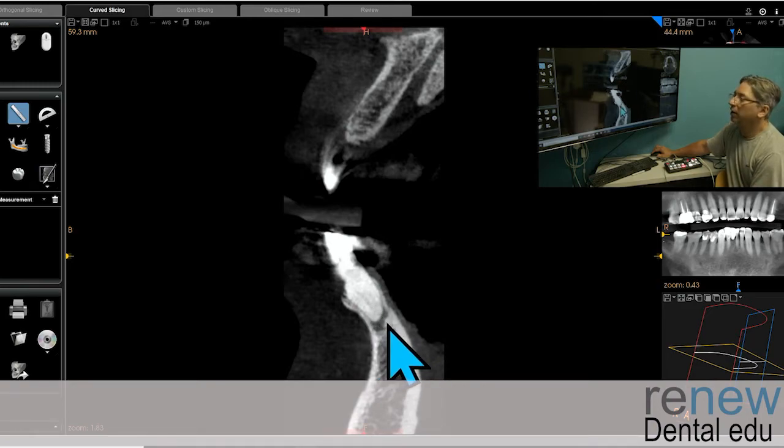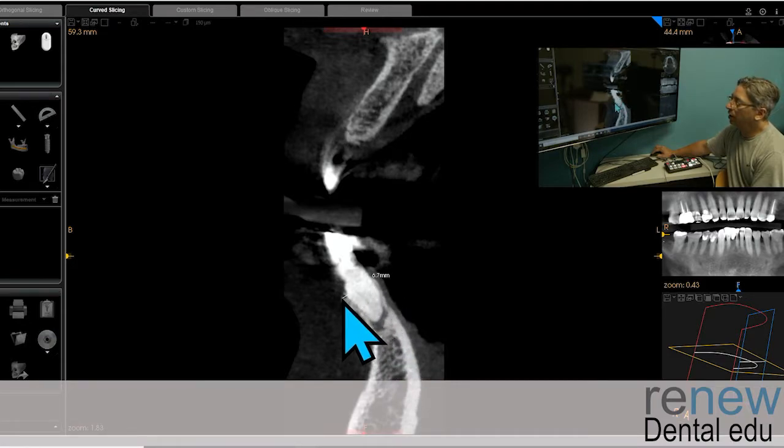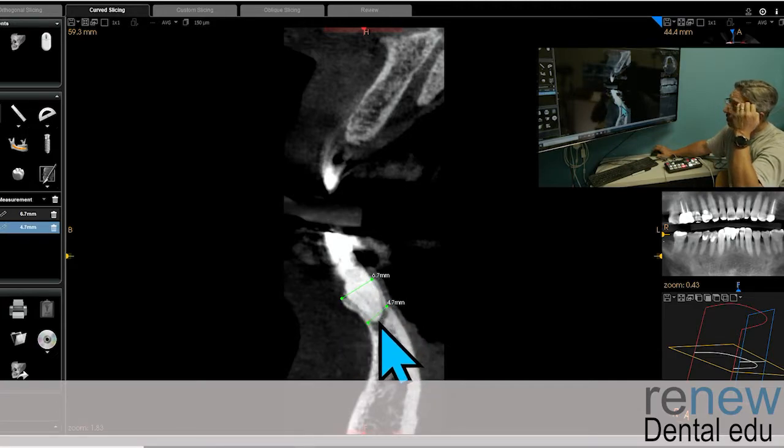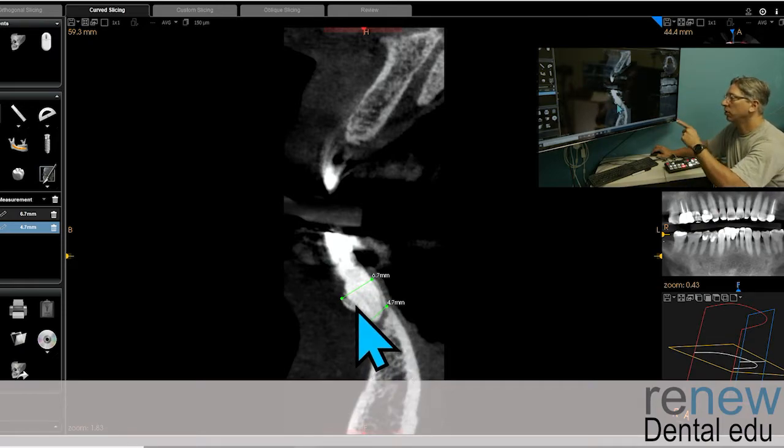He also has a big endodontic issue now because of that. She's into the nerve. So if you extracted this tooth here, you've got about 6 millimeters. Well, we have to look at the constriction area, which is, like I said, problematic. I've given a yellow on this case here. But if you had a 3.5 and you had this kind of width, there's a possibility of this working out okay because the facial bone is so good here.